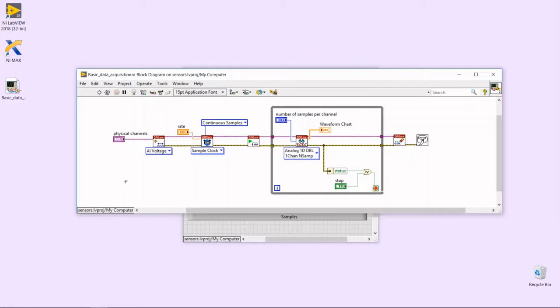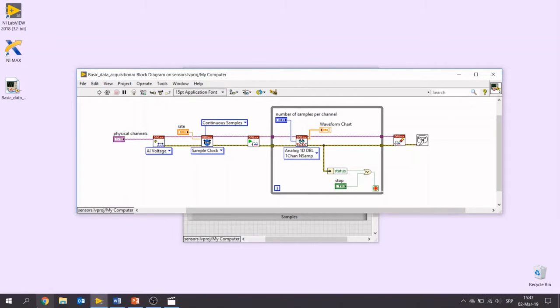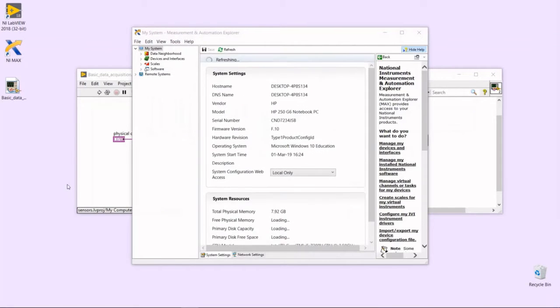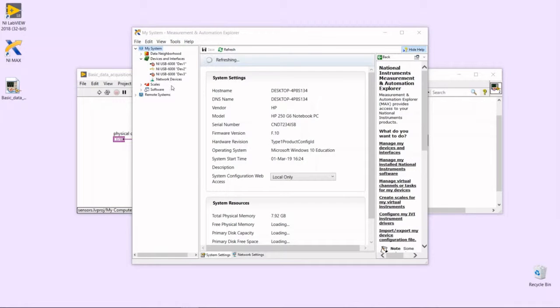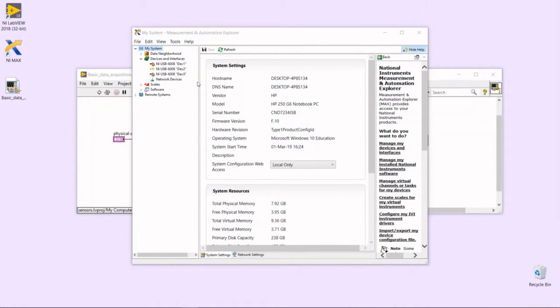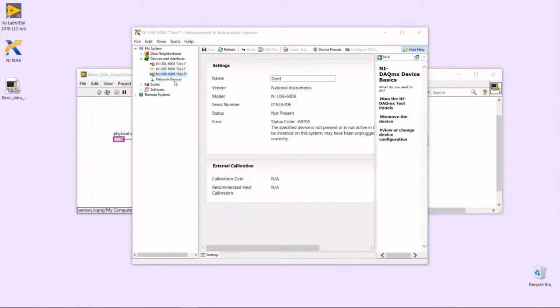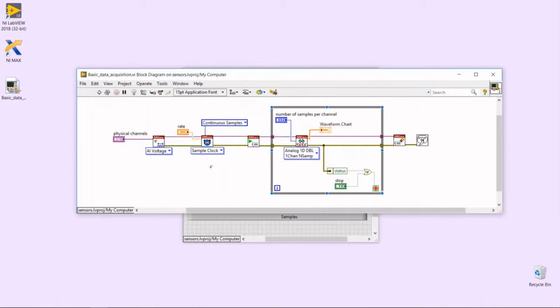Okay, before we go through that, I'm going to start the MAX so we can see the difference between real and simulated AD card. In devices and interfaces, we can see which cards are simulated, which cards are connected, and which are not connected. So device 2 is simulated because it has a golden USB sign, and device 1 and device 3 are real but not connected AD cards because they have this black USB sign with a red cross on it. When we connect the device, we are going to have only the black USB sign. Okay, I'm going to close MAX and go back to the application.